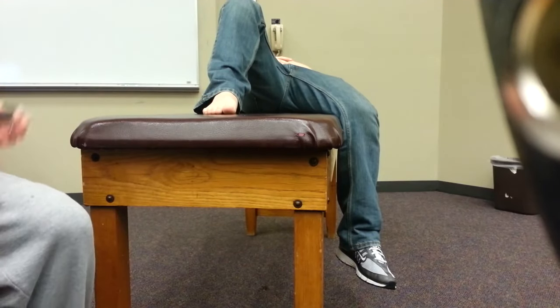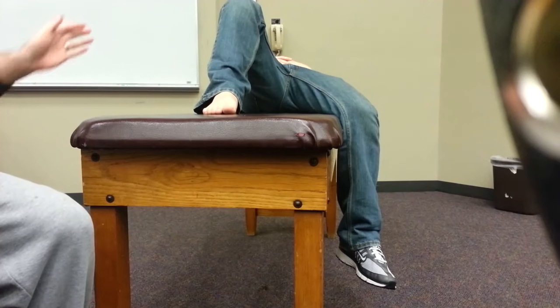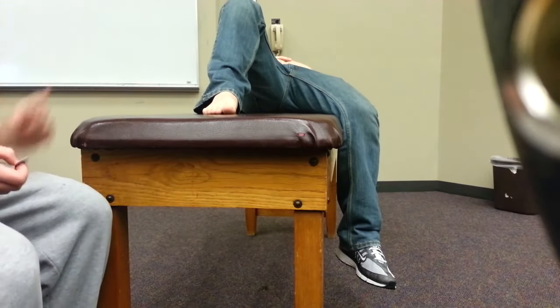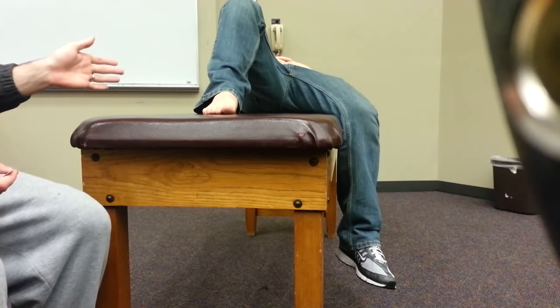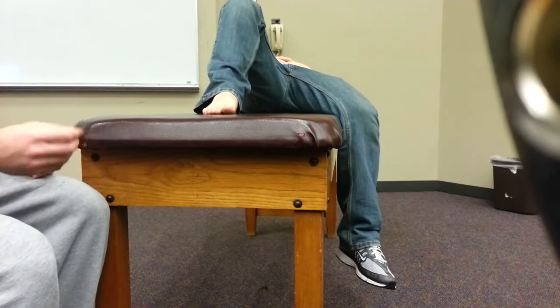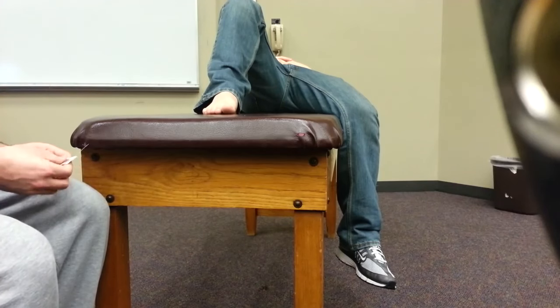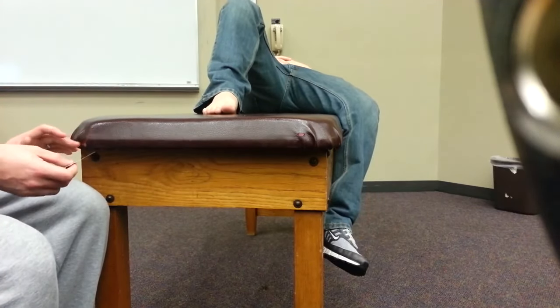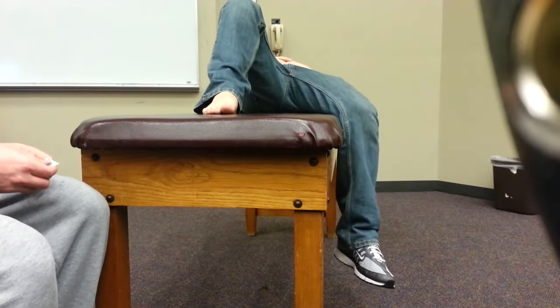A failed diabetic monofilament test is when the patient has multiple failed sites — and when I mean multiple, I mean three, four, five or more. If the patient has one or two failed sites, that could be normal, because if a patient has calluses, corns, or warts, it could interfere with sensation, and we all know that a callus can be typical. So one or two failed sites doesn't really tell you much. But when you start failing three, four, five locations, it can clue you into diabetic neuropathy.